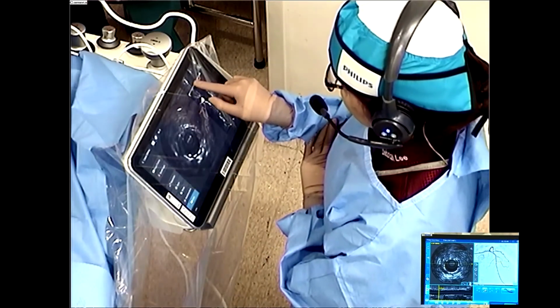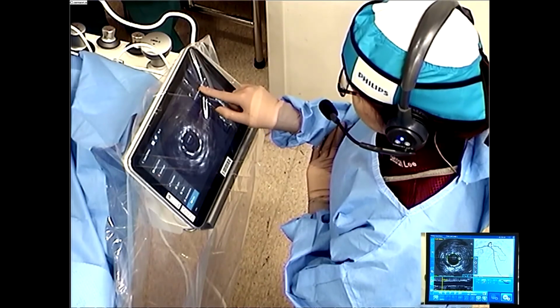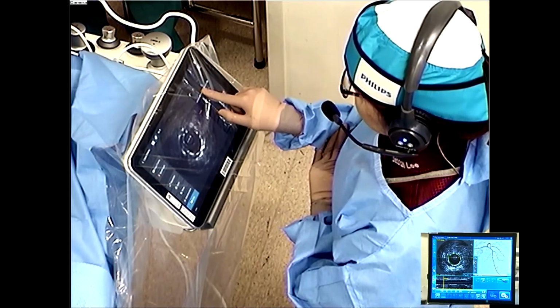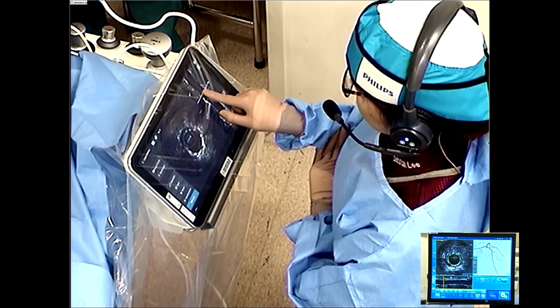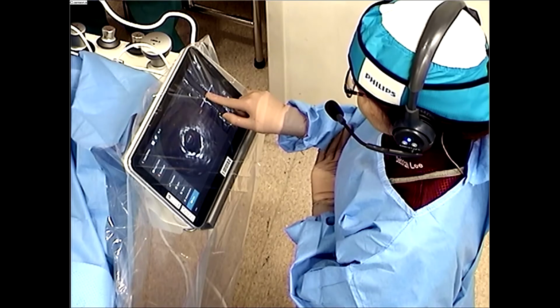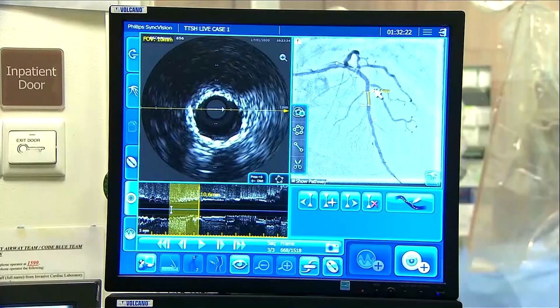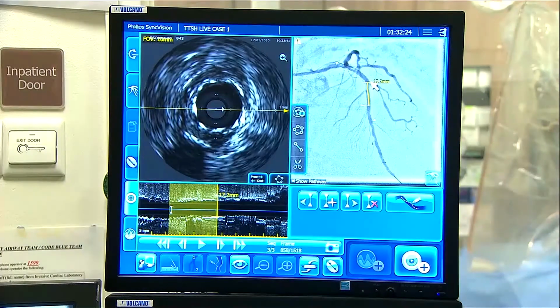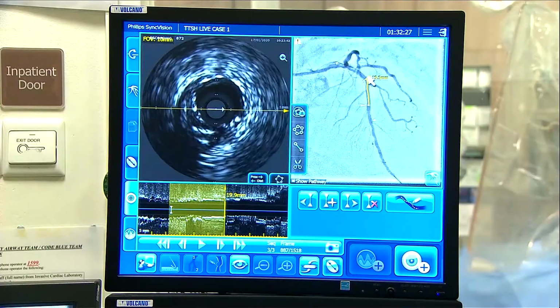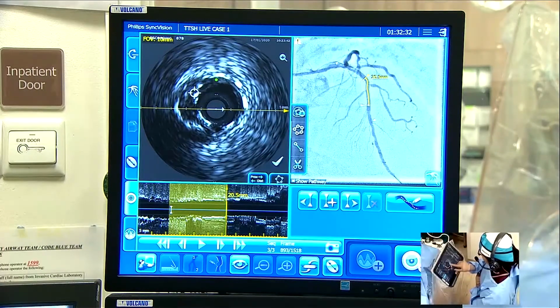Yeah. Can you see that? This is really, really useful, and it's really intuitive. I have to tell you that this is the second time Deborah was playing with this. But obviously, the younger people are a lot slicker with these apps-based and touchscreen-based systems than us. Okay, so now Tony is just going to move it a little bit higher, maybe just past that band. Here, how about here? Yeah, just a quick measure. Maybe let her do it. Okay, yeah, I'll just stop Tony doing that.